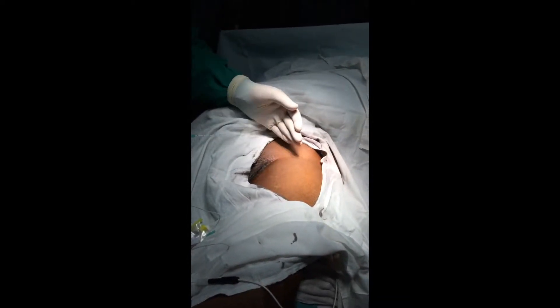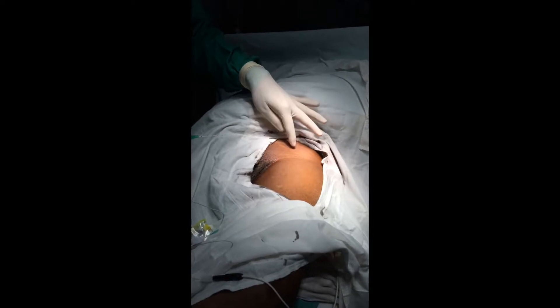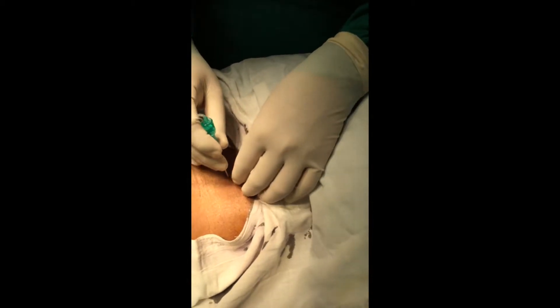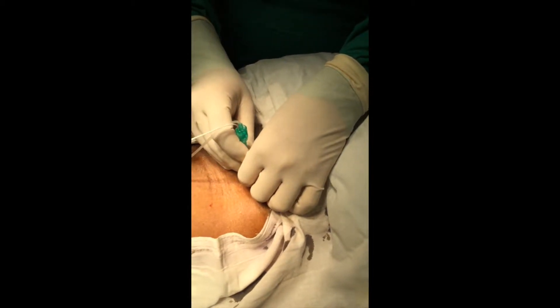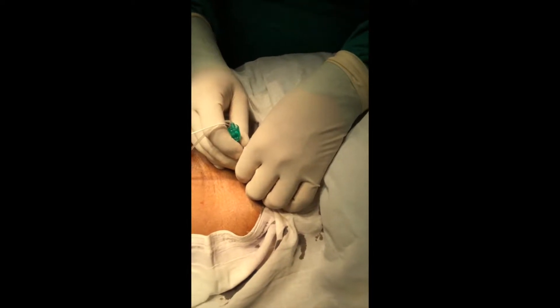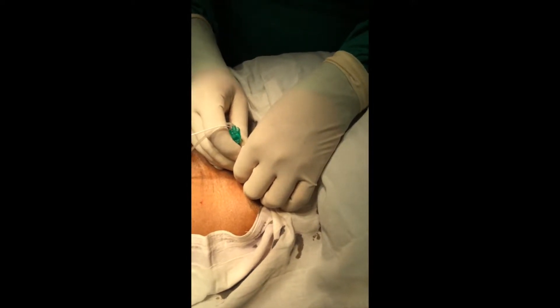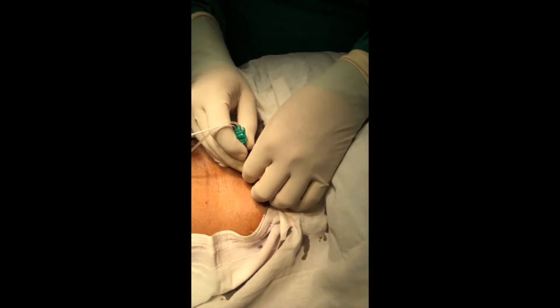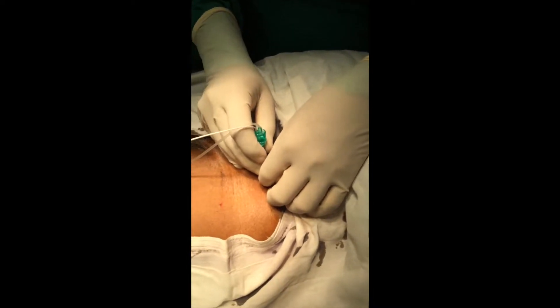Entry point: anterior superior iliac spine and pubic tubercle divide into medial two-thirds and lateral one-third. We go one centimeter below that point, perpendicular. We have just punctured the skin and now looking for the pop from the fascia lata, then bounce, then followed by the pop from the fascia.